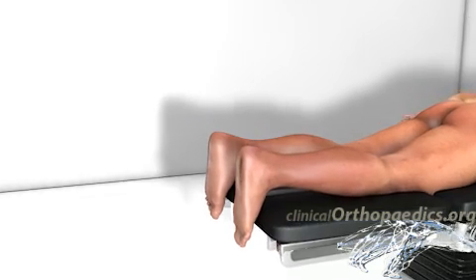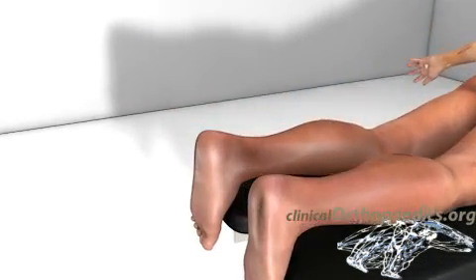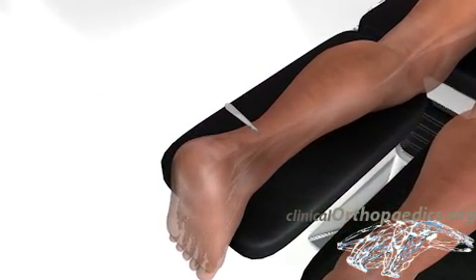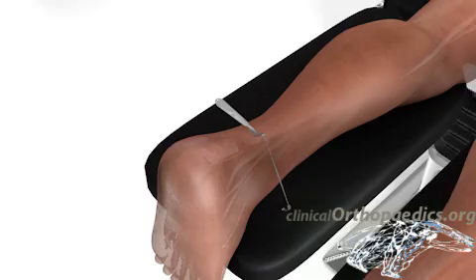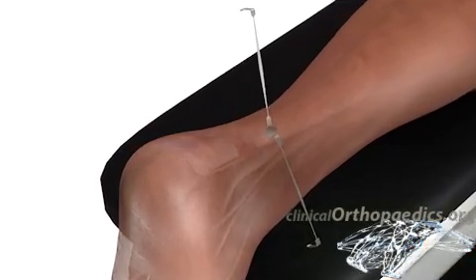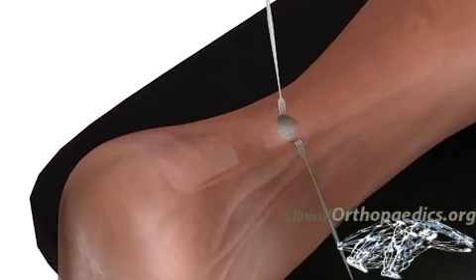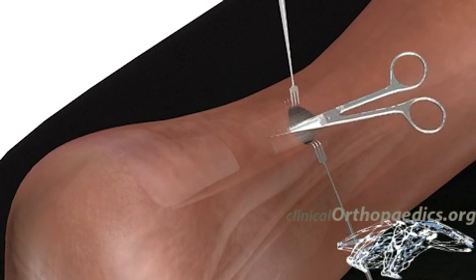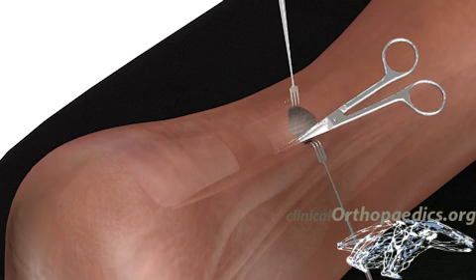Mini invasive surgery requires only a small incision made three centimeters proximal to the rupture. The skin, subcutaneous tissue, and fascia are sharply divided without injuring the tendon sheath. Tunneling is then performed in the layer between the fascia and tendon sheath using scissors.